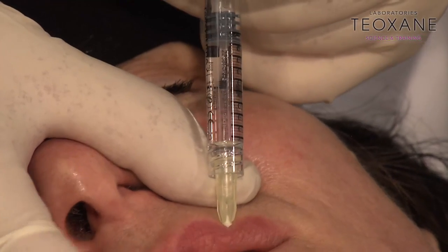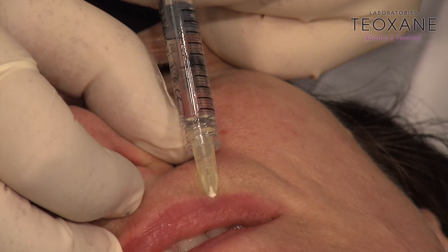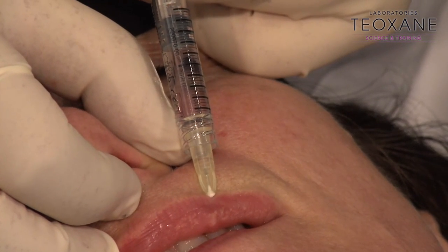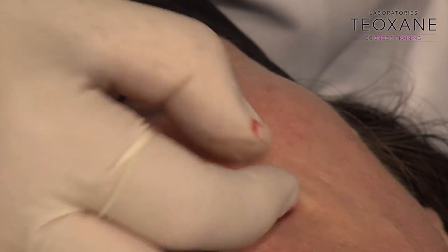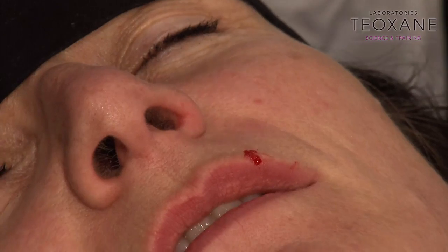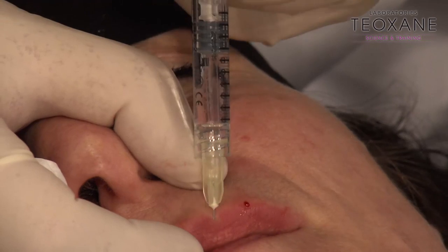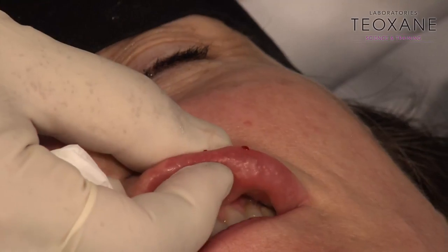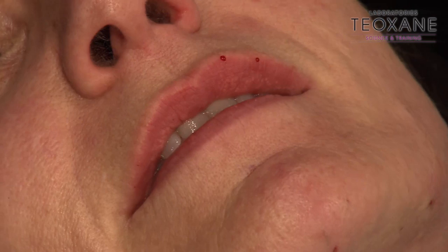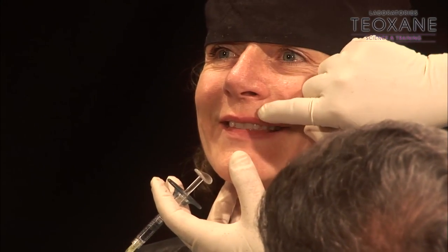Look, in. I go in instead of staying. And now I'm going to inject inside. Do you see what's happening? And I'm going to sculpt, press. I hope you see the difference. Yes, we see it. Okay, same thing, 2 dots. See, quite deep. Voilà. Can you see? Okay. Now, you can see the two lips are different. If you check, can you check without? Very good, yes. You see the difference? Yes. You see, it's much fuller here than here.